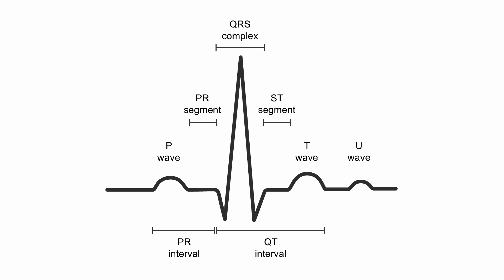In terms of the baseline, what's typically used for exercise stress testing is the PR segment. Let's review what that is. Here's our P wave, and it's very easy to see where the P wave ends — though that's not always the case. Where the P wave ends is where the PR segment begins. Where the QRS begins is where our PR segment ends. So this is our PR segment right here, and this is our baseline, and this should be at roughly the same level as our ST segment.